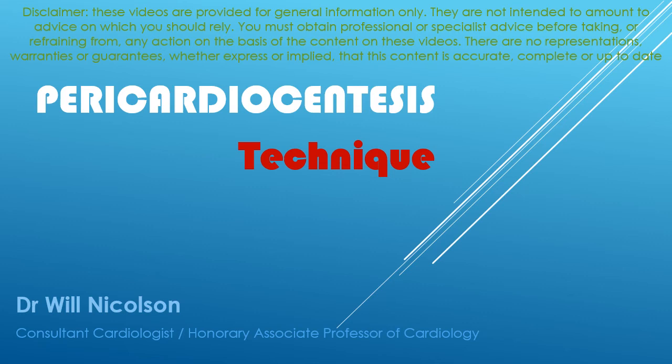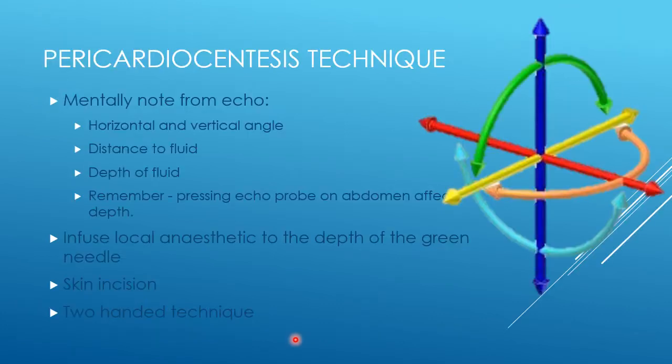Pericardiocentesis technique. The purpose of this section is to talk about how we use the anatomy and the different tools at our disposal to do the procedure. So these are generic points for how we use the equipment. So now we come on to pericardiocentesis technique.